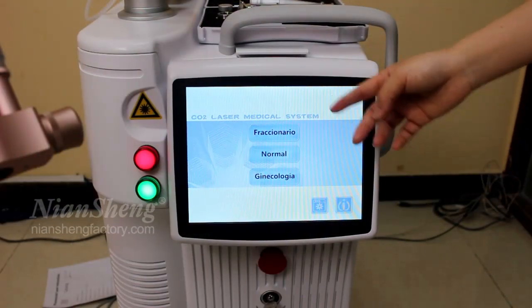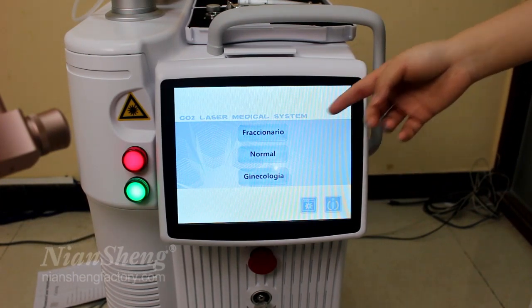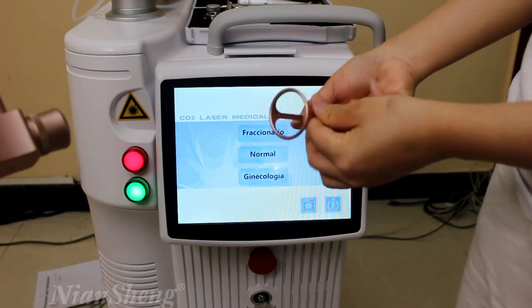These are three different treatment interfaces. The first one is the fractional laser treatment interface, and usually we are using this working rod to do the treatment.